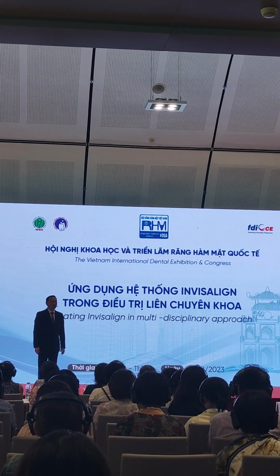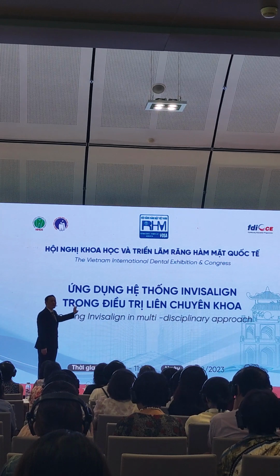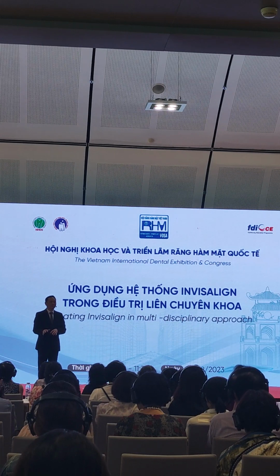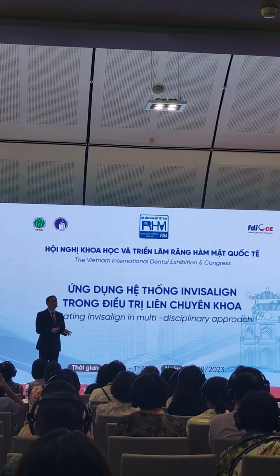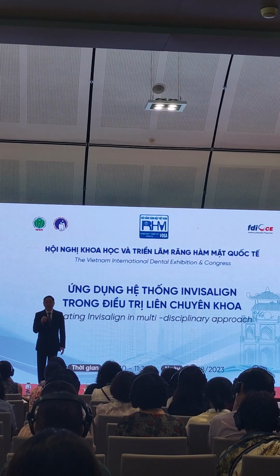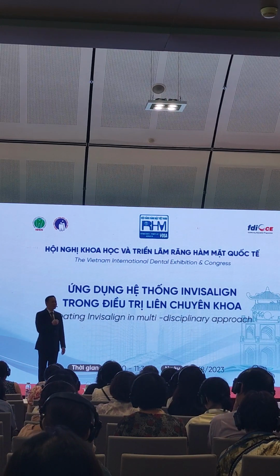But during the treatment, whether you see it in a ClinCheck or in a clinical sign, you see this premature contact. Okay, it's just like friends that come to me every day. But I know it won't hurt. It's just a transitional stage that will affect the patient's chewing function sometimes. But the patient can get used to it.